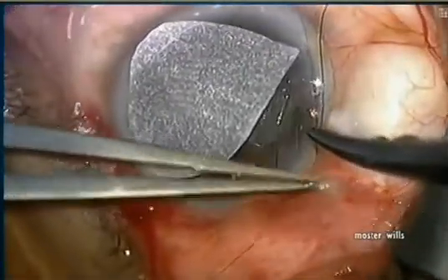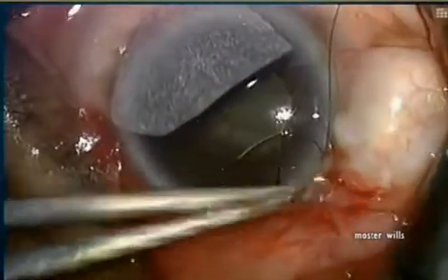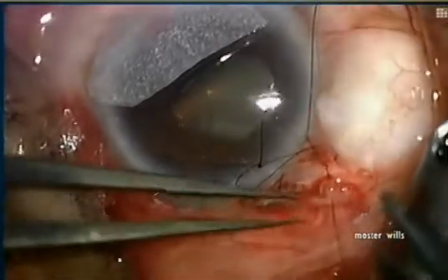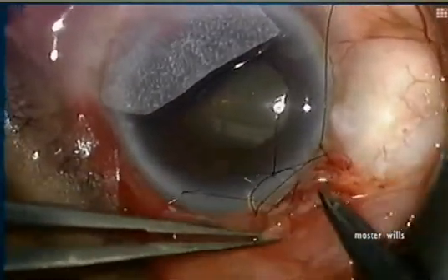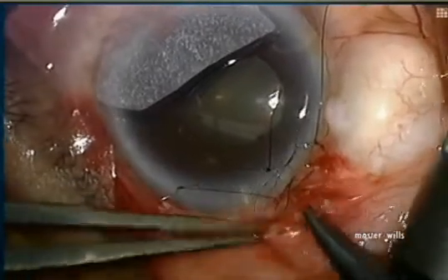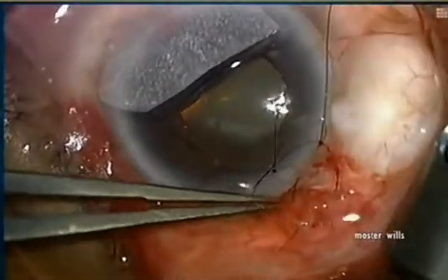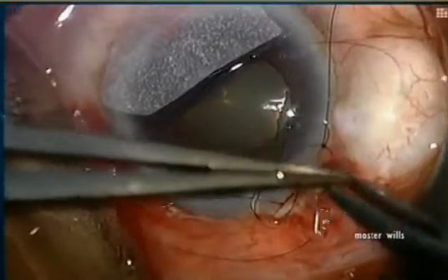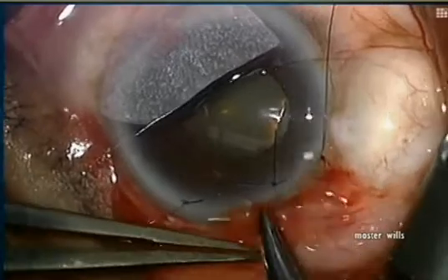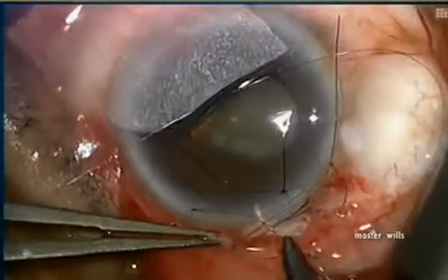Now it's time to close the wound. Because mitomycin C is used in these procedures, it's imperative to have a watertight seal. The 10-0 nylon places two bites first at the limbus through the conjunctiva and then goes underneath the edge of the conjunctiva in small bites. It's imperative that you don't include the edge of the conjunctiva in your closure, because then you will form a purse string.